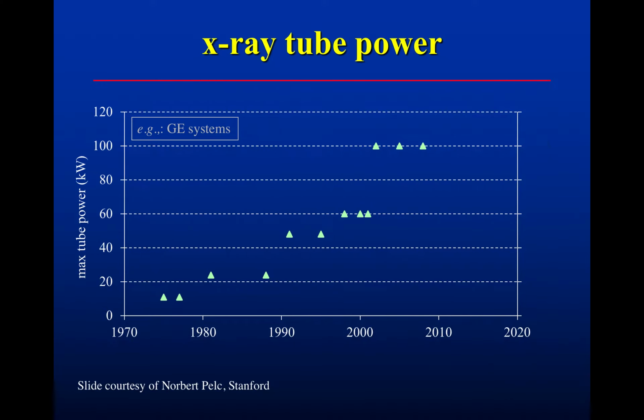In order to do that, one of the things you need are X-rays in a short amount of time, right? So if you have 5 minutes to image a patient, you don't need a huge burst of X-rays because you have 5 minutes to collect all these X-rays. If you're trying to collect all of this information in 140 milliseconds, you need a lot of X-rays in a short period of time.